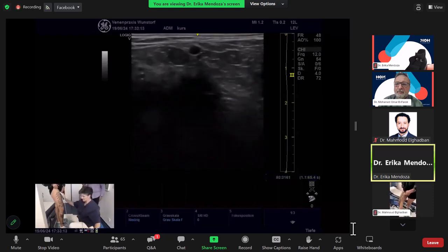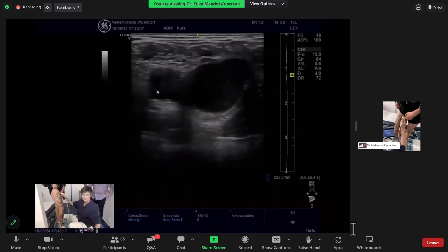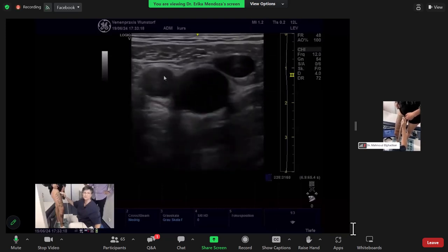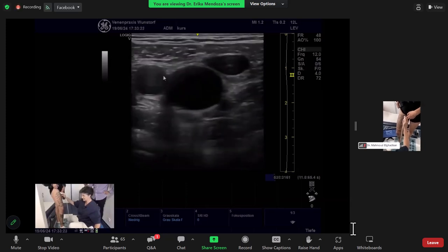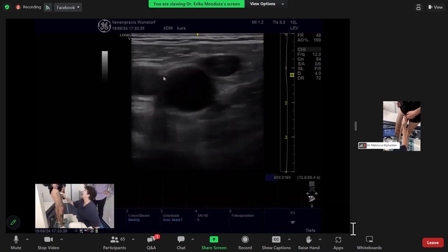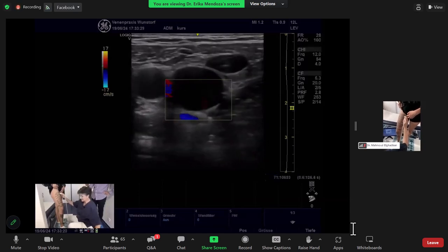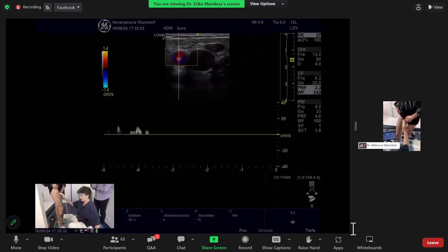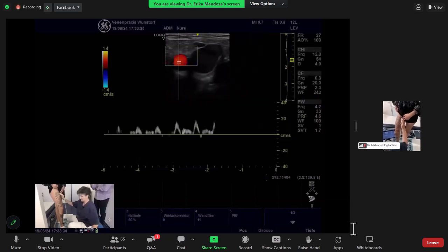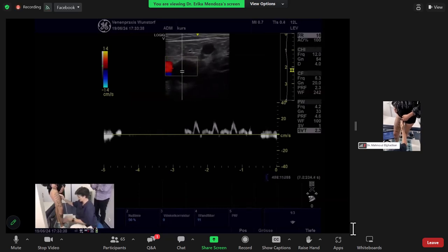You see everything? Yes, we can see. This is the common femoral cross-section, the Mickey Mouse appearance. Perfect. The Mickey Mouse: the vein, and the artery. She's alive. And this is the deep vein. Let's go with the deep vein first.